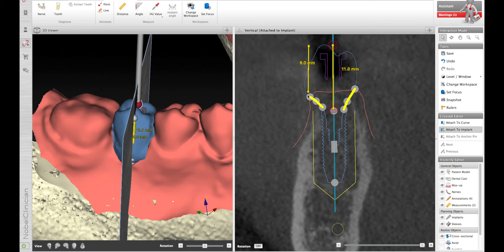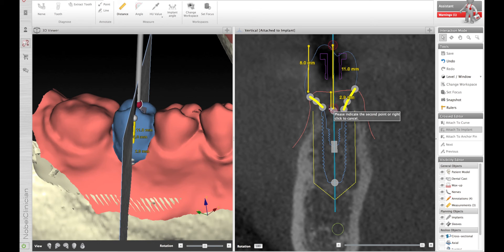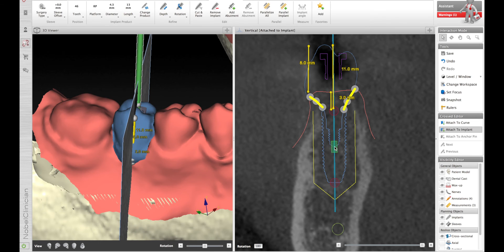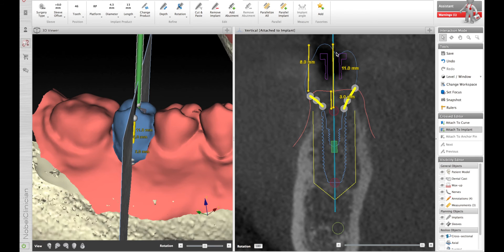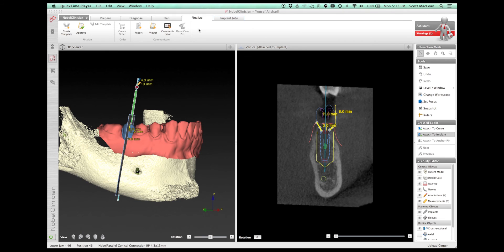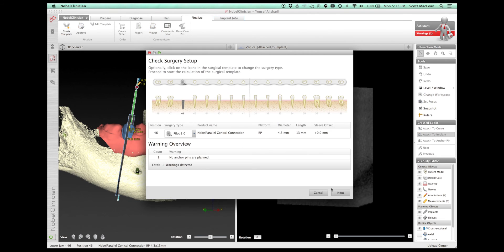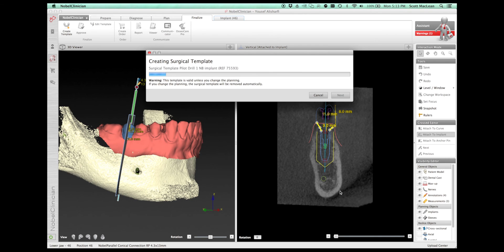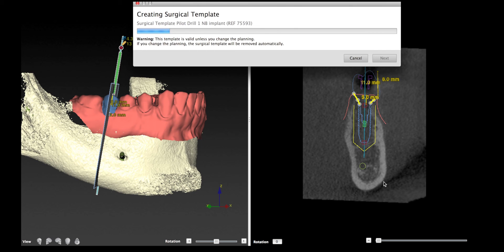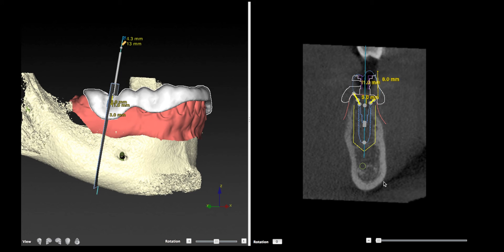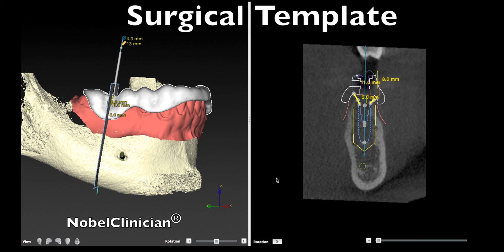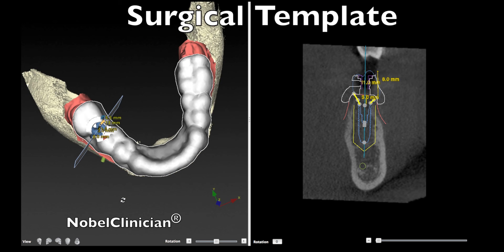One of the most predictable outcomes I see: if we don't place the implant deeper and leave it just at where the bone is now, we'll have crestal bone loss because the bone is so thin and not properly sealed. We need to plan the case to sometimes place the implant a bit deeper. The template enables us to predictably place the implant, perform bone reduction, and position everything ideally for long-term success. We also have the ability to plan the screw channel so it exits right out the central fossa, and we can know what the emergence profile will look like before placing the implant.